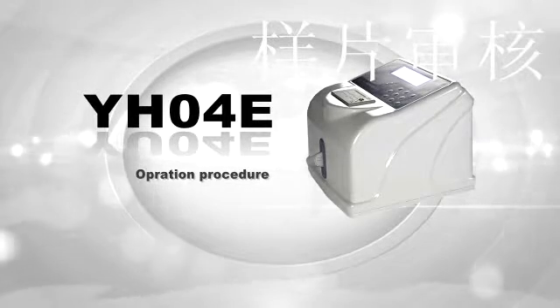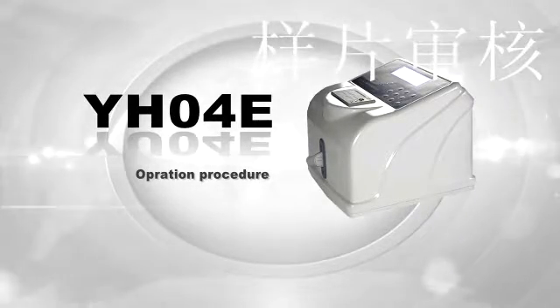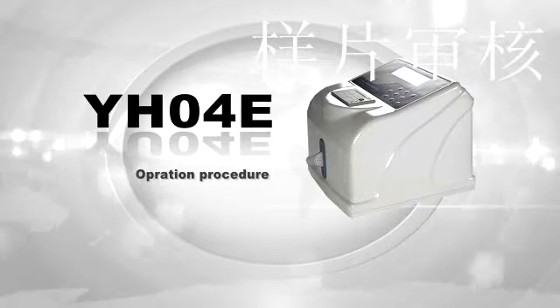Thank you for using Headway's YH04E Helicobacter pylori detector. In this video, we will introduce the functions and show you how to operate and calibrate it.